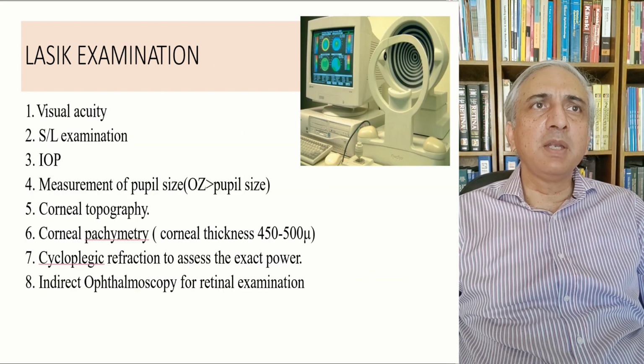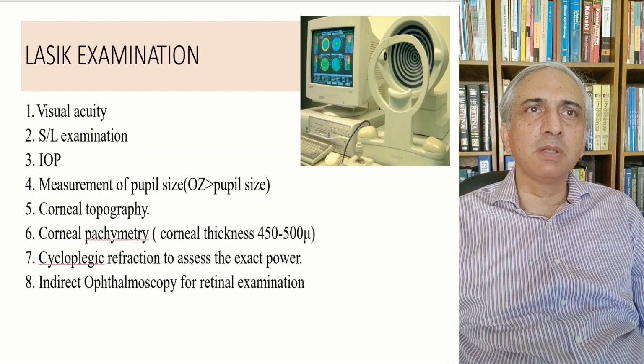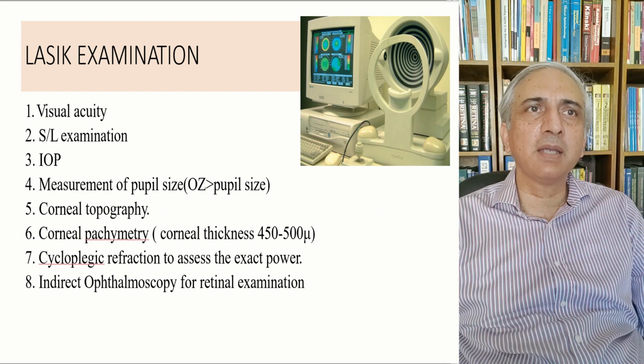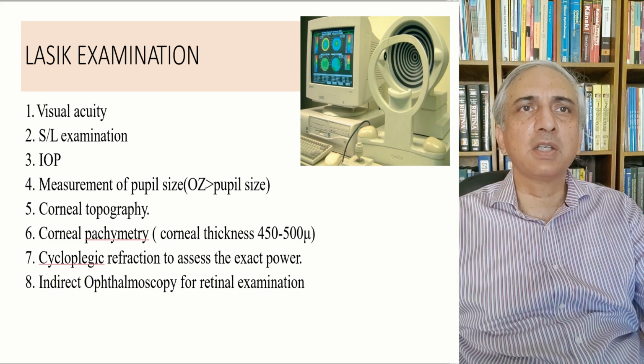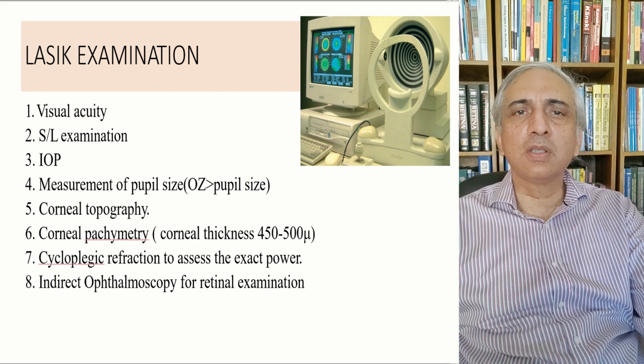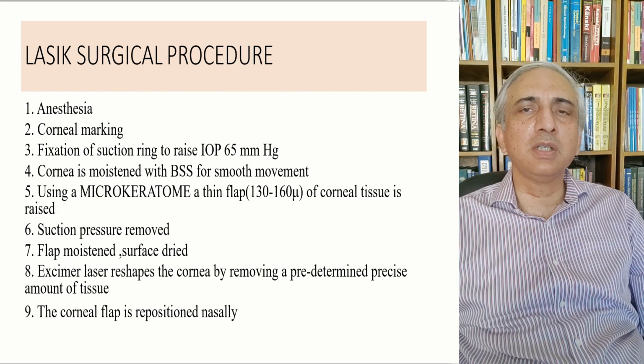So LASIK examination: visual acuity, slit lamp examination, intraocular pressure measurement, measurement of pupillary size, corneal topography, corneal pachymetry, cycloplegic refraction, and indirect ophthalmoscopy for retinal examination. These are all the things which we've discussed before as well. So the LASIK surgical procedure is slightly different.